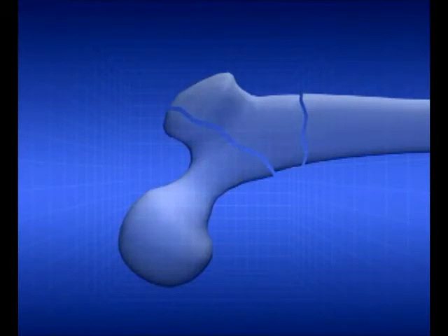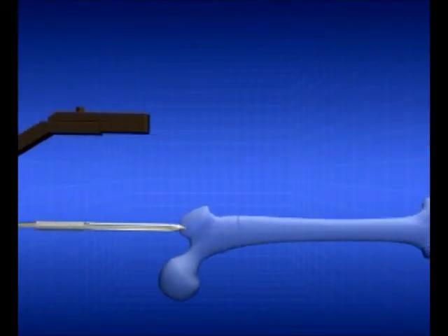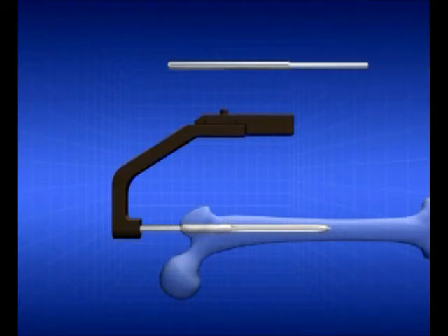Procedure: The fractures are reduced and an entry hole is perforated via the greater trochanter using an awl. The nail is gently inserted. Under fluoroscopy, the K wire is inserted through sleeves into the femoral head to fixate the reduced fractures.